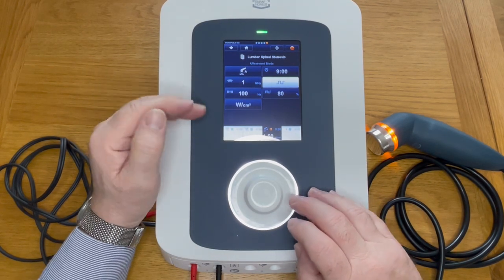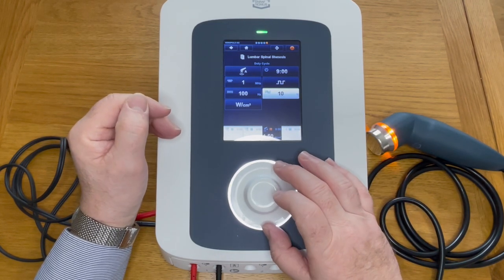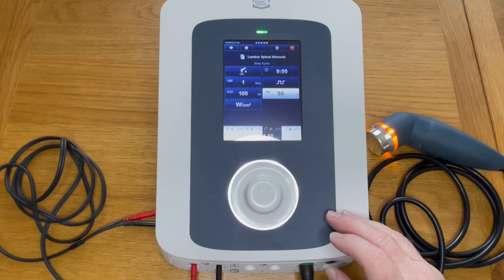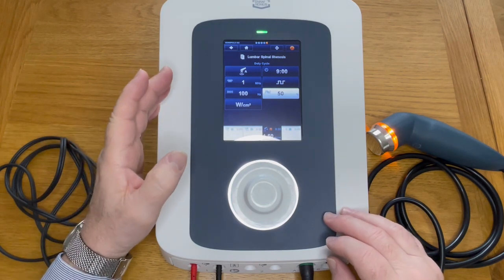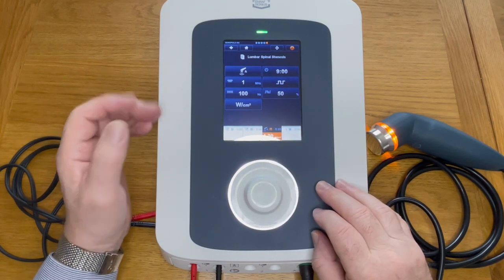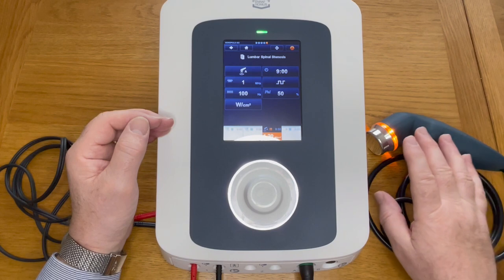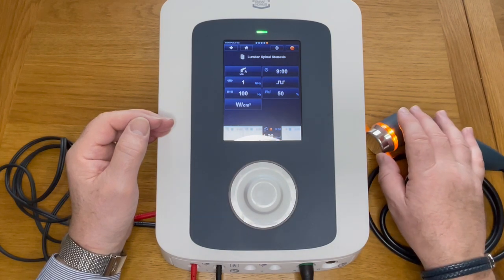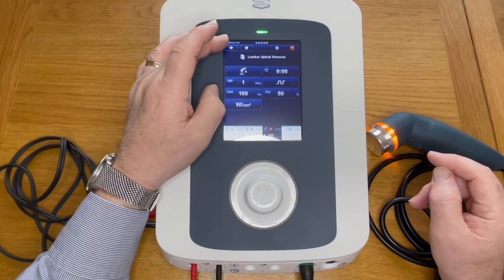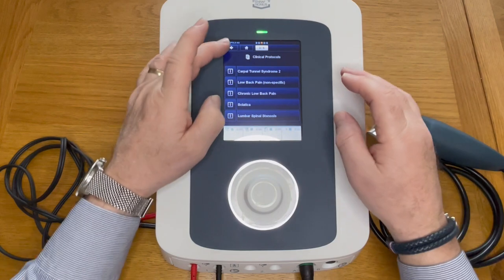Pulse mode is something everyone adjusts to suit themselves. The output can go right down to 10%, though in practice below 50% has rarely been used as the power output is quite low. It automatically goes to 1.5 watts per centimeter squared, but you can change that. Once the applicator is applied to tissue, the indicator changes to green and output starts. It will not start while in free air, and if you lose contact it will pause. To stop, press stop and navigate back.